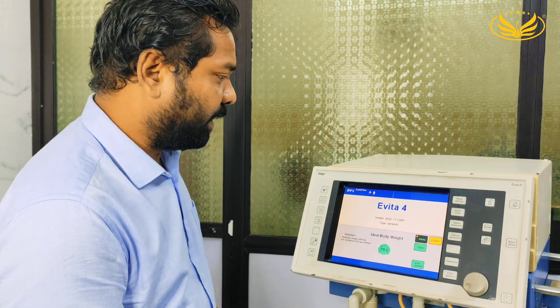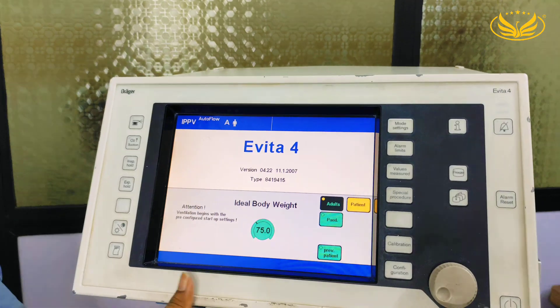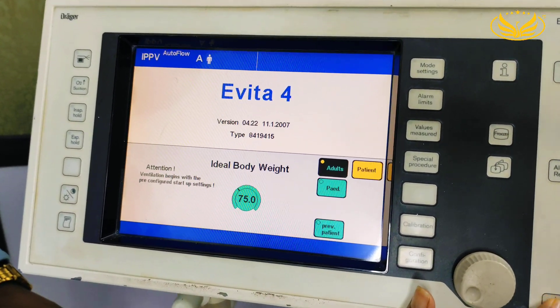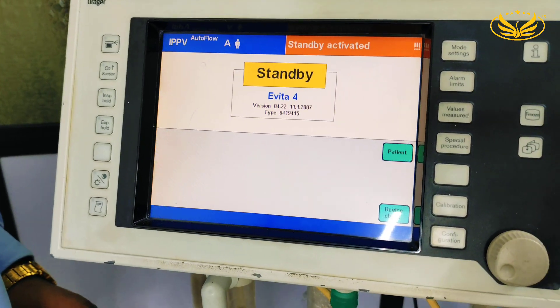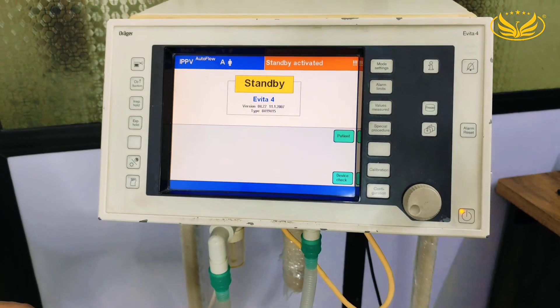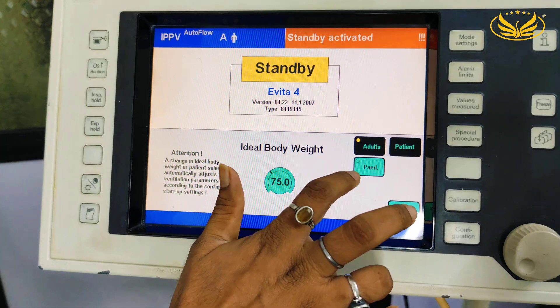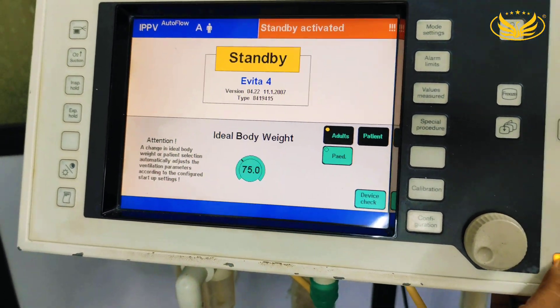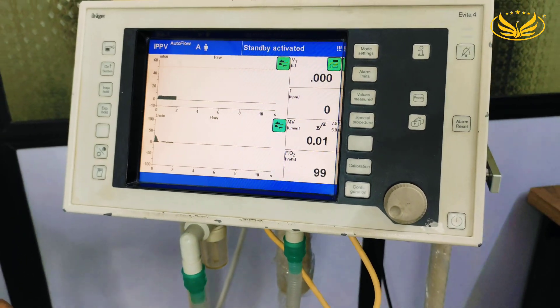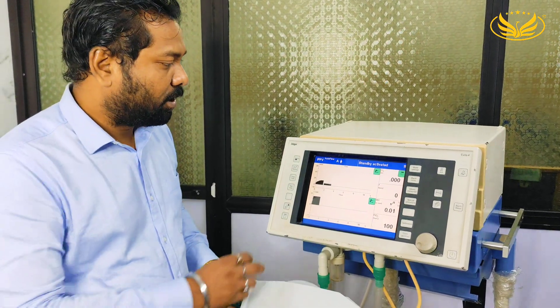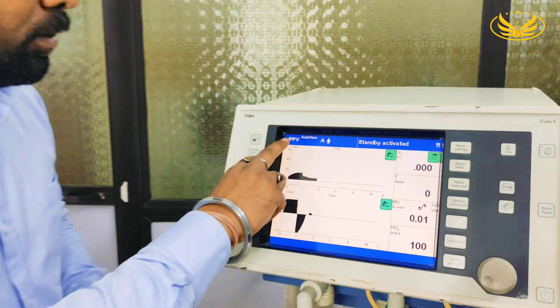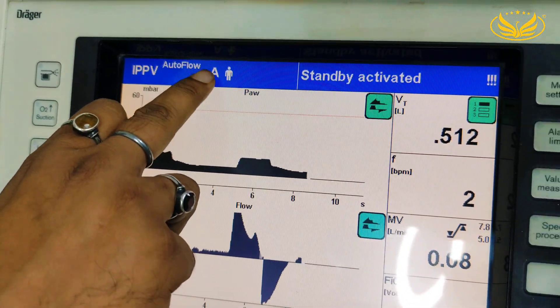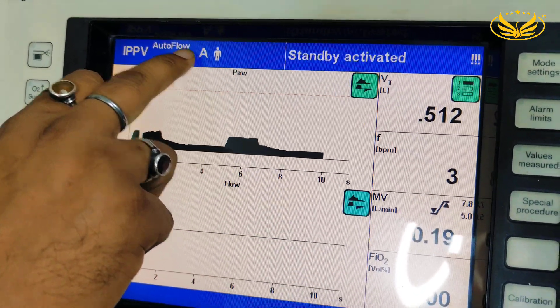Now let me start this ventilator. You can see this is the standby button — we have to press it for 3 seconds. Now this ventilator has got activated and from here we have to choose patient type: adults or pediatrics. So we choose adult. Now after activation, ventilation has started. You can see the mode which we are using is IPPV, that is CMV. SA indicates adult and we have kept autoflow.